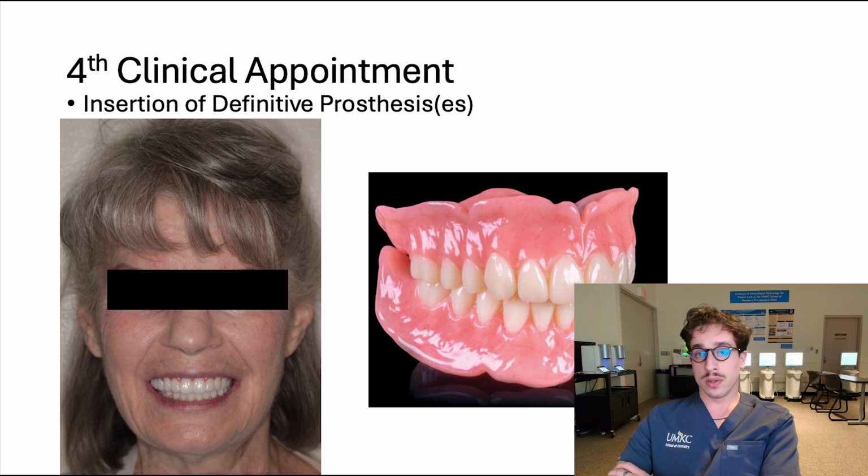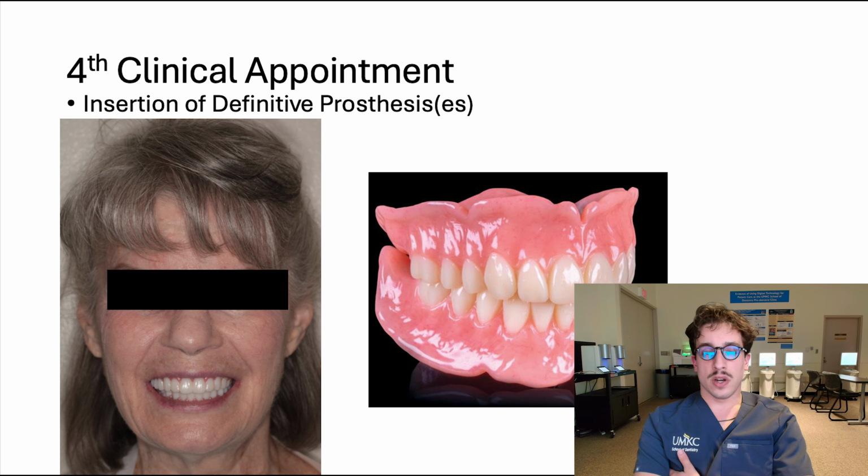One of the things anecdotally that I have seen is generally these don't require as much adjustment as conventional dentures do. A big reason for that is because within the processing phase of a conventional denture, there is always a level of distortion that is present. But like I've said a few times by now, we're fabricating effectively our final denture off of our final impression. So there's fewer steps, fewer things that could go wrong, and smaller amounts of distortion. And so generally on the intaglio, these fit like a glove.